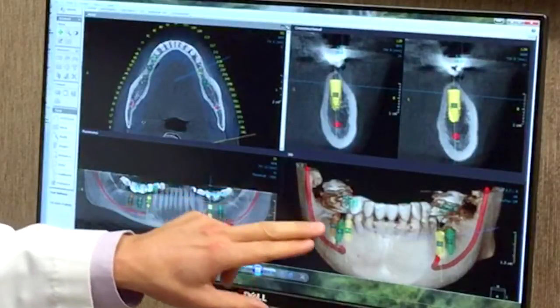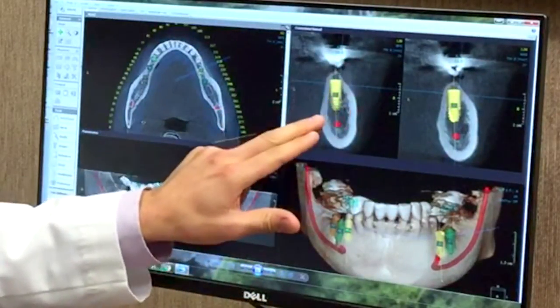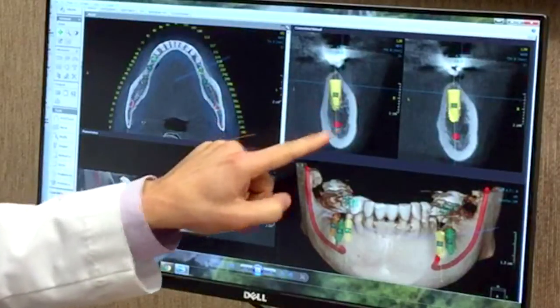Having a three-dimensional x-ray allows us to not only be very careful about that nerve, but also plan for the placement of the implant. The implant is in yellow here. We plan for the placement of the implant to be in the perfect position, so that way we're watching out for any anatomical structures.